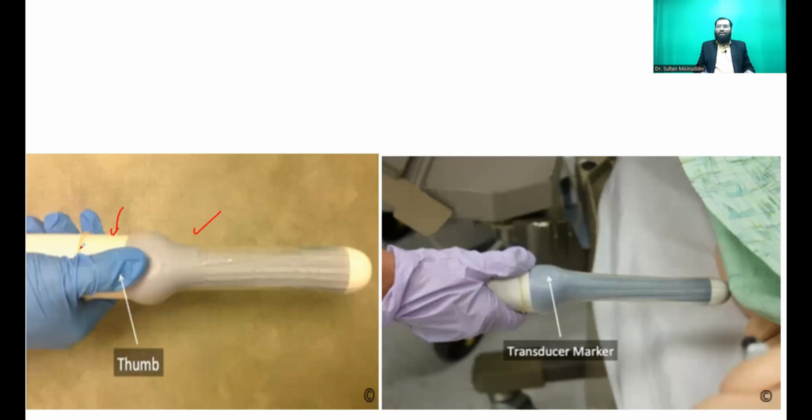Always follow universal precautions whenever you do TVS ultrasound. Always take care: if the patient is bleeding, you need to apply a poly drape below so that your bed or table doesn't get soaked with blood. This is very important. These are practical points not mentioned in books. But when you take a patient for ultrasound and then find that your bed is filled with blood... So most important, take consent.